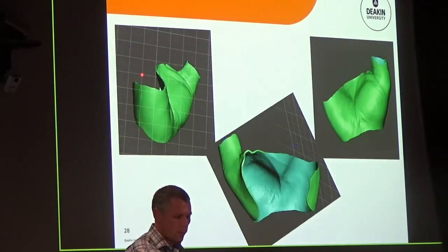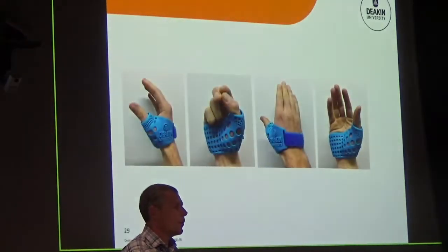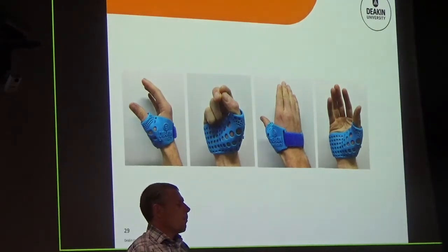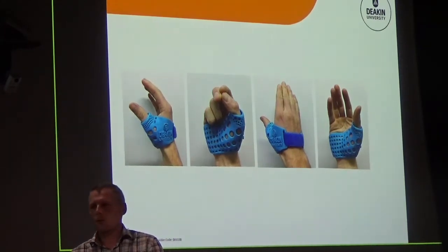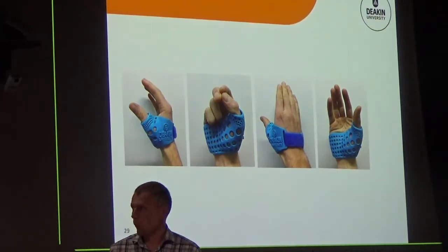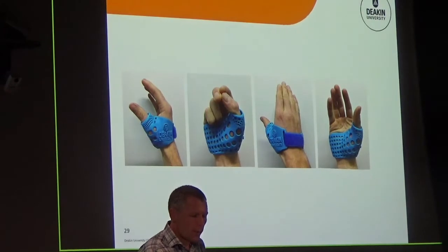And then with a little bit further design, I won't take any credit for this. This was an engineer that then took it to that level. Put it in shapes, put it in branding, put it in whatever you like. But there's principles also in terms of how it is done. So that process from scan through to modify and then to print then creates some of these objects.